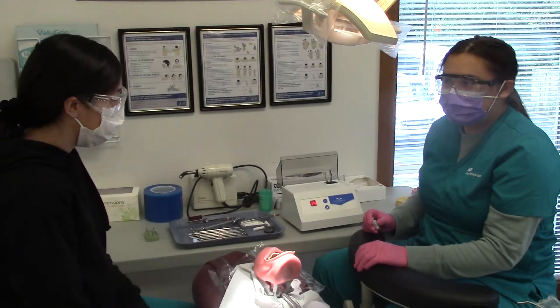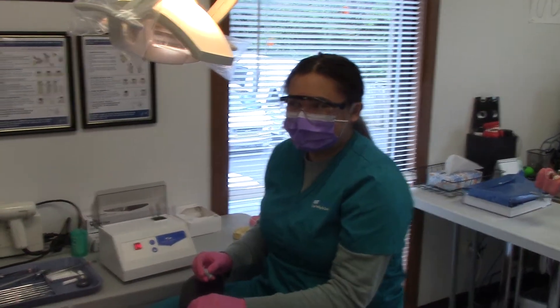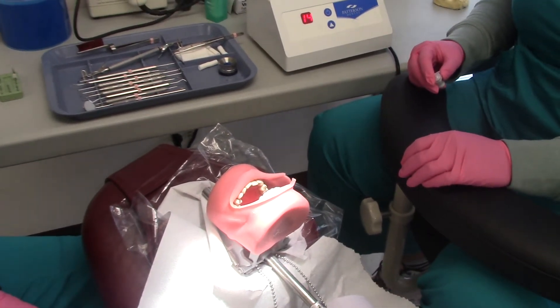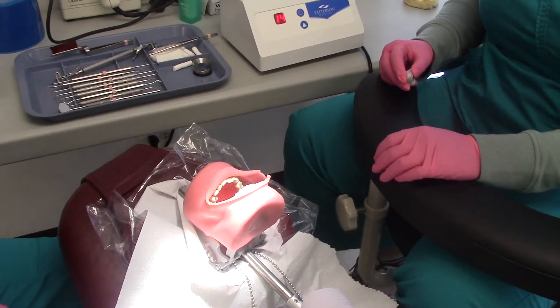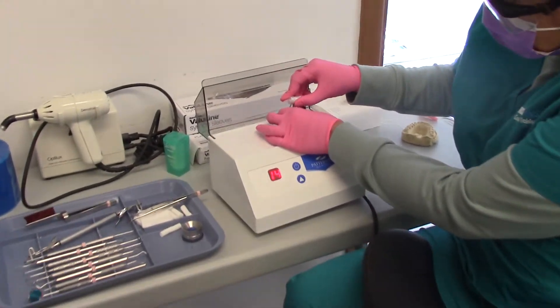Today we have students practicing amalgam. Anna is being the doctor and Kaitlyn is going to be the assistant. They've already done the prep and prepped the tooth. Now the tooth is prepped, so Kaitlyn is going to load the amalgam in the amalgamator.